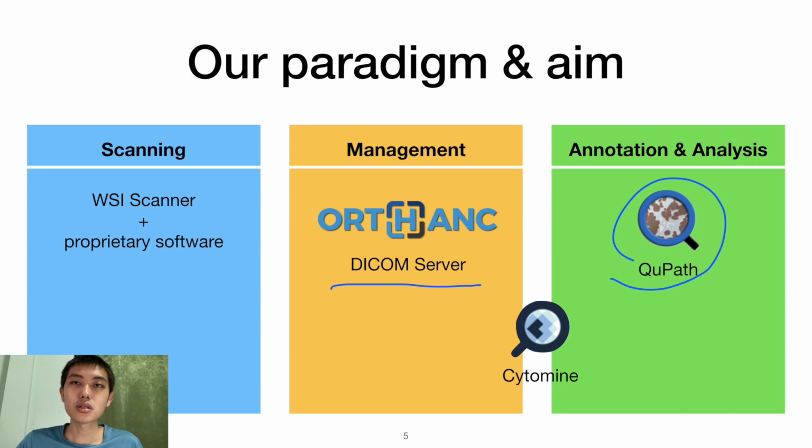You can also use Cytomine in between here, management and analysis, since it has different modules to deal with different tasks. The problem is none of the components in each area really works with each other. For example, there are 8 or more whole slide image scanner vendors, and most of them don't work with each other, and to our knowledge, none of them works with the DICOM server.